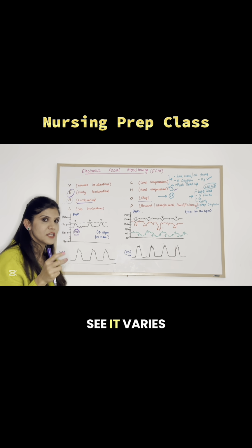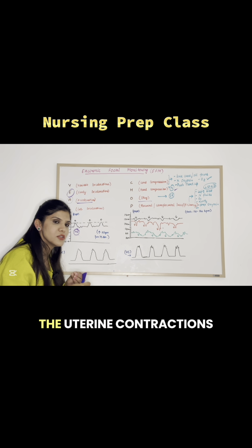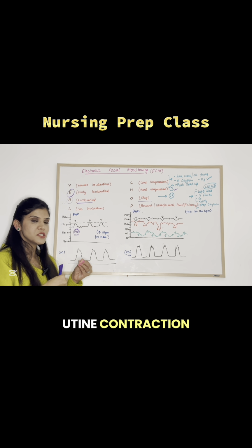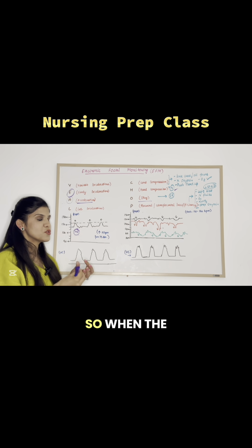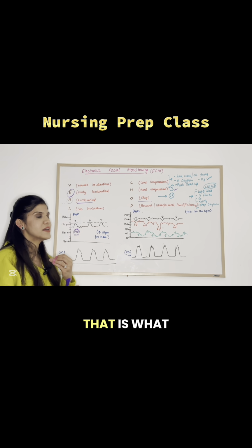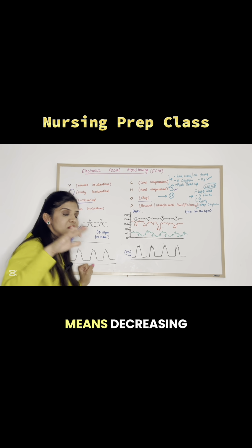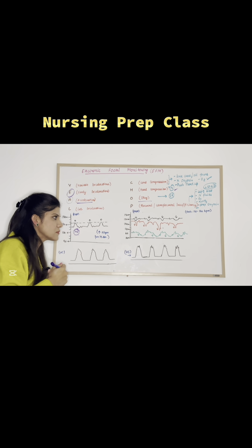So if you see, it varies. So the dipping varies. Somewhere it is dipping along with the uterine contractions, somewhere it is dipping before the uterine contraction. You can even see a dip after the uterine contraction as well. So when the pattern varies like that, that is what we call variable decelerations. And deceleration means decreasing. So this is decrease in the heart rate.